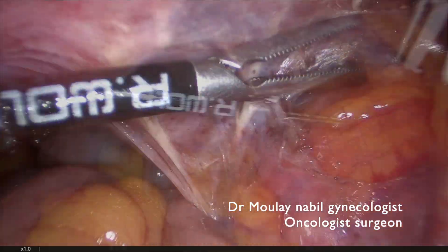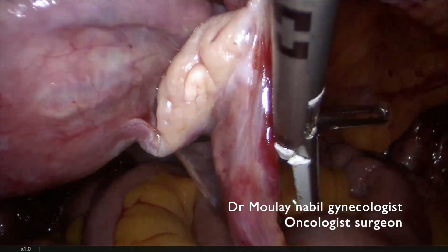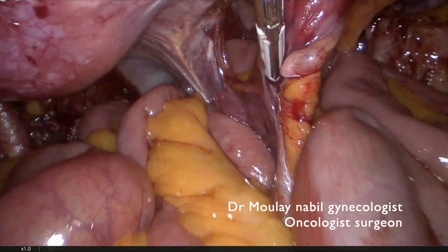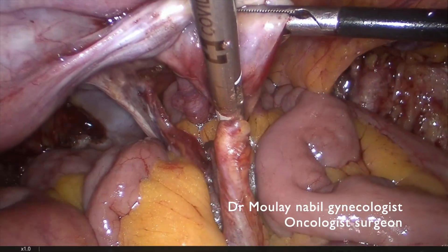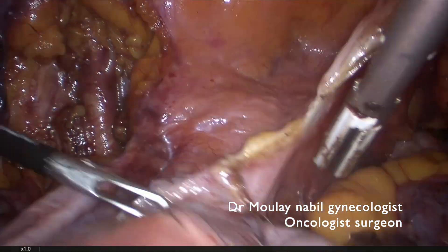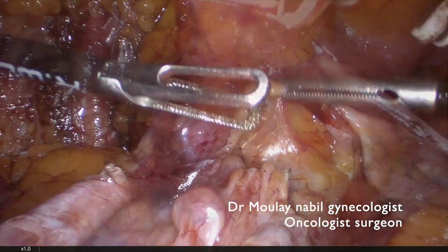You can see how we are in trouble with this bowel and you have to pull it up every time. We have to work with 10 mmHg pneumoperitoneum. We continue by sealing and cutting the right IP ligament. It is important to seal 2 cm to have perfect hemostasis. Now we begin the basic bladder dissection. It is important to follow the model for the right dissection of the bladder, particularly in this fatty patient.